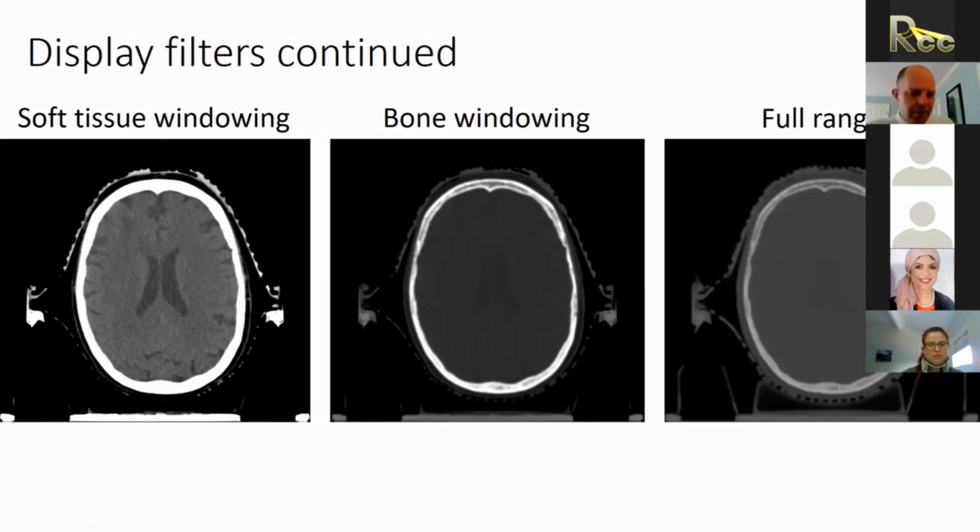Another good example, I don't have a slide here for it, would be in the lung. Often the default windowing will be very good for soft tissue that's around water density, but not good for lung, where you have the lower densities. So when you're matching in the lung, it's good to keep both your planning CT and your cone beam CT in a windowing that allows you to see whatever density you're matching. And if it's lung, it may be a lot lower than what your standard windowing would be.